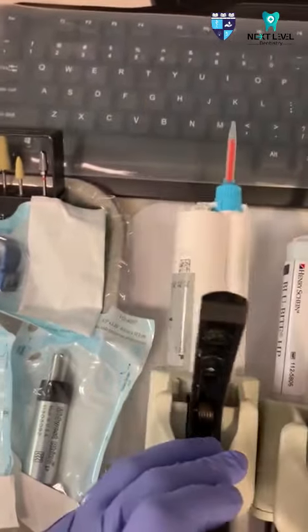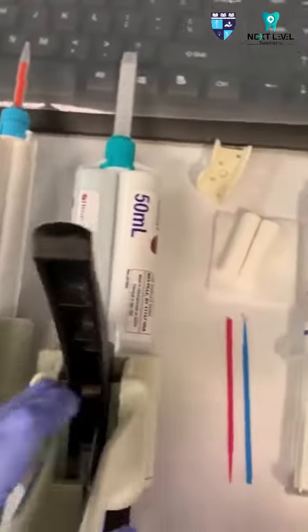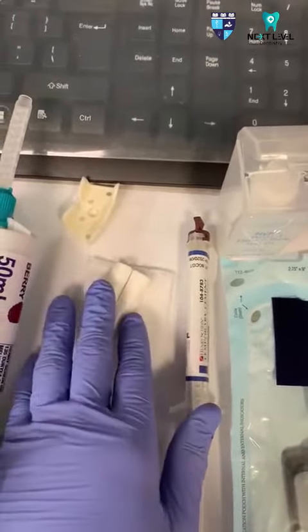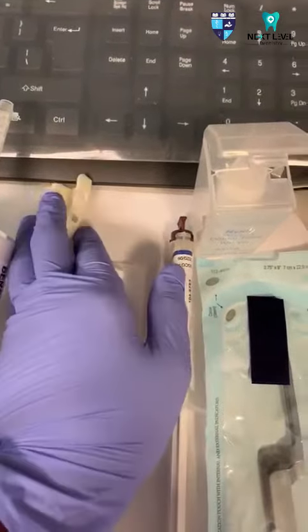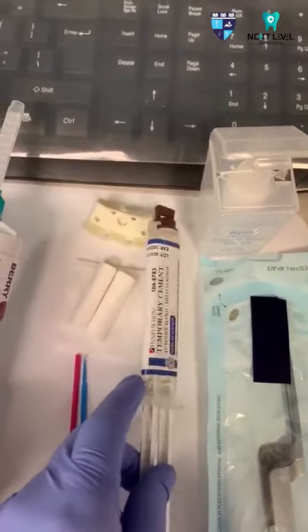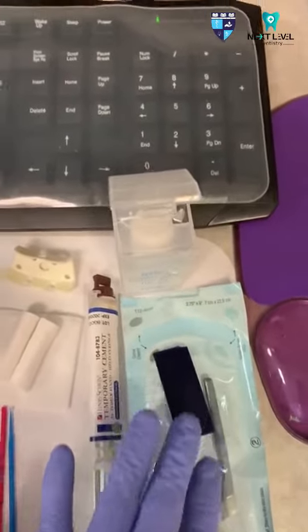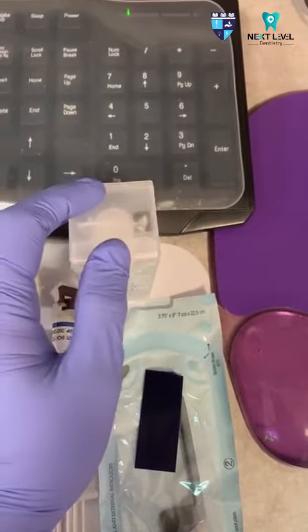We should also have our temporarization material, our blue bite registration material, our micro brush tip to actually clean the gingival area after the crown has been cemented, a 2x2 and a cotton roll for moisture control and isolation, our small tray for the bite registration material, our temporary cement to cement the crown, an articulating paper to adjust the occlusion of the patient before we cement the crown, and a floss to check the contact space.